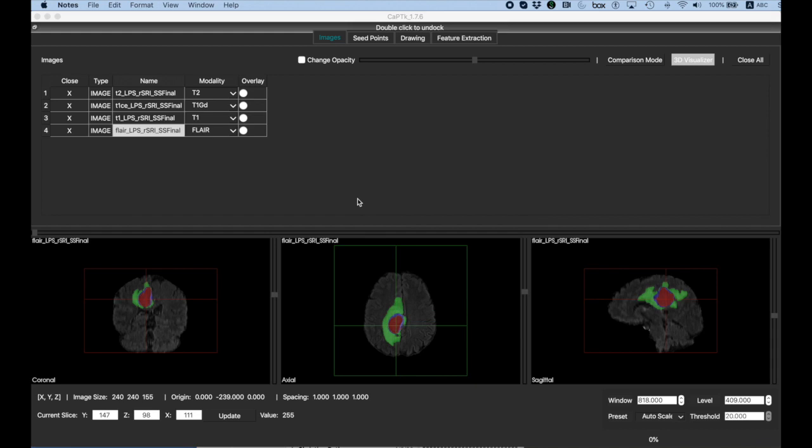Here's the results for the tumor segmentation showing the three distinct regions of the brain tumor. I do also want to note that although here we are presenting brain tumors as an example, users can apply this method in other settings. For example, if you have at least 100 annotated data sets for breast, lung, liver, or any other lesions, you can use DeepMedic to train a segmentation model and apply it through CapTk.